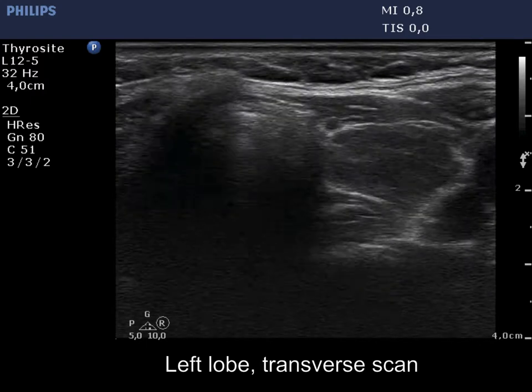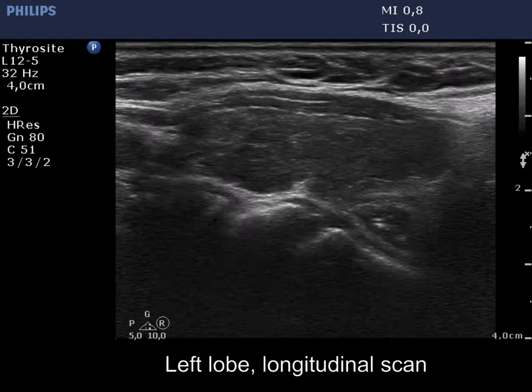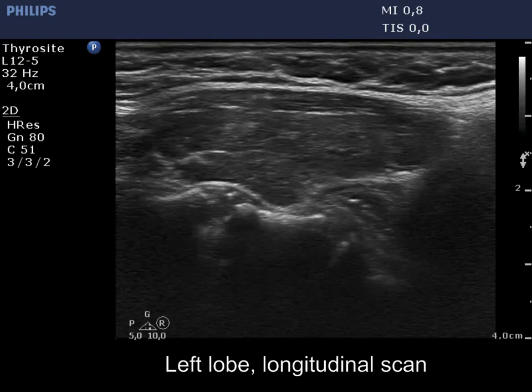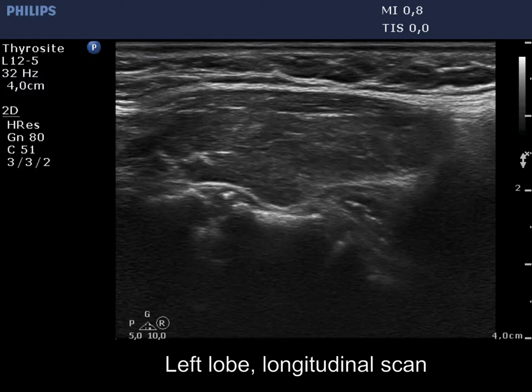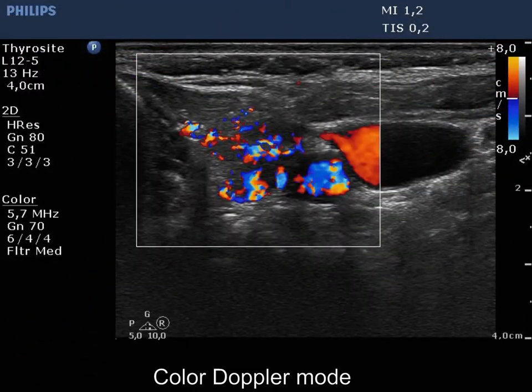The left lobe is not enlarged; otherwise its pattern is identical to the contralateral one. The vascularization is significantly increased.